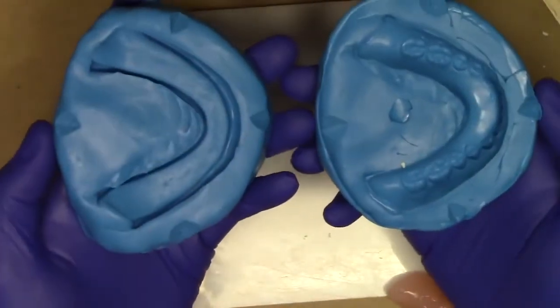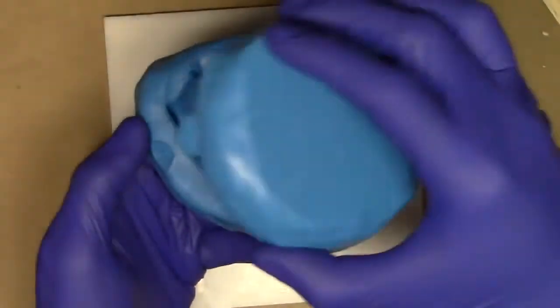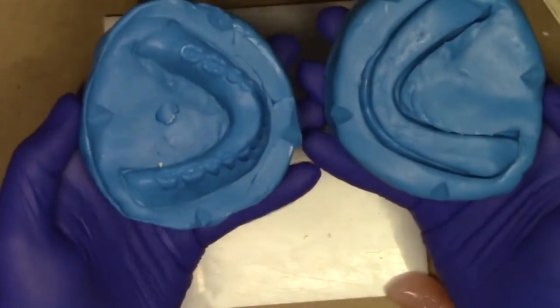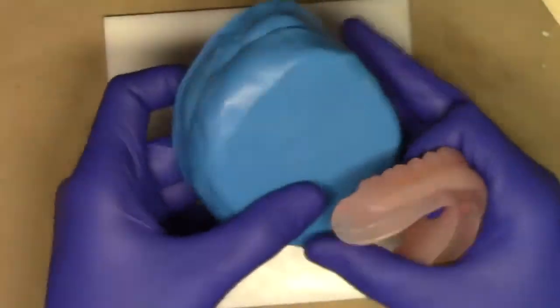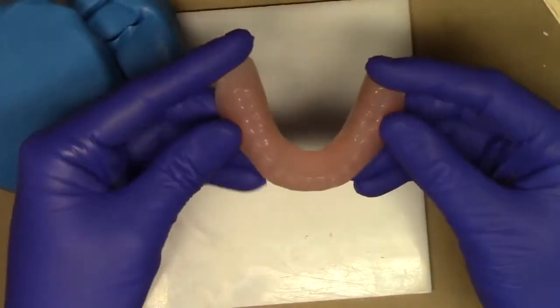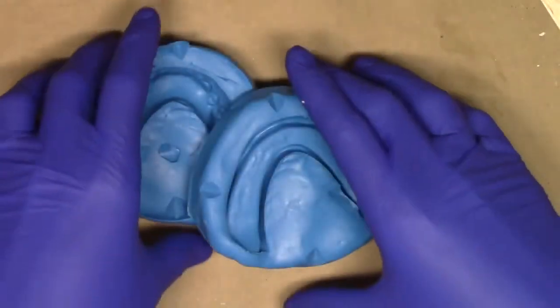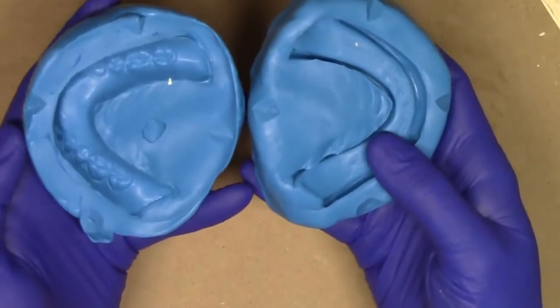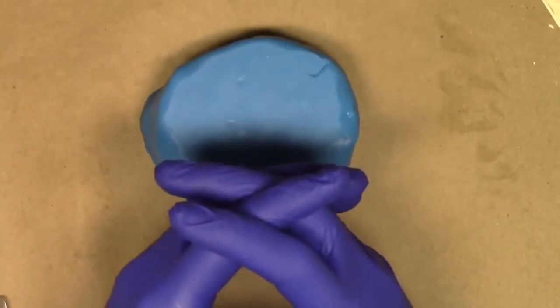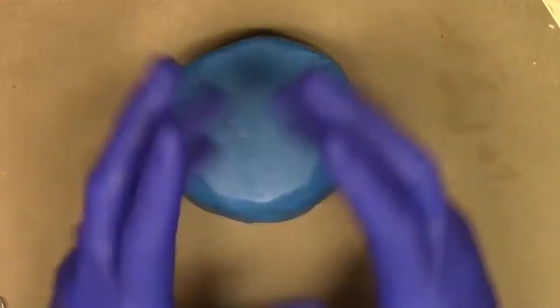The general idea of the putty technique is now I can take a clear orthodontic resin, fill it in here, and then combine the two of them together and put that into a pressure pot device. When that has been completed, this is ready to get sent to the laboratory. You can take your patient's existing complete denture, clean it off of the petroleum jelly, and return it to them. Now, once the putty duplication portion of this procedure has been completed, you can return your patient's denture back to them. This procedure can be completed now independently of the patient, and you can dismiss them.